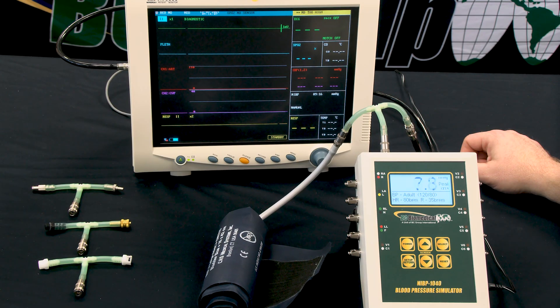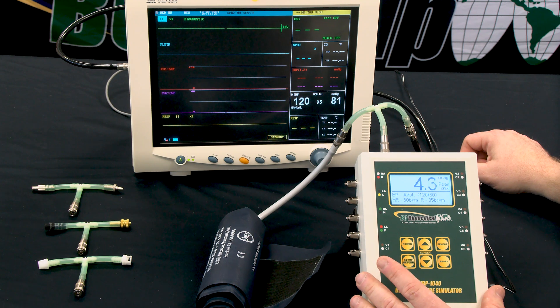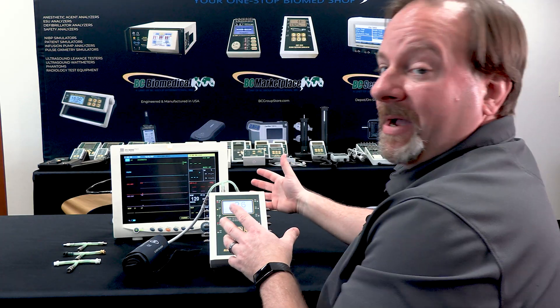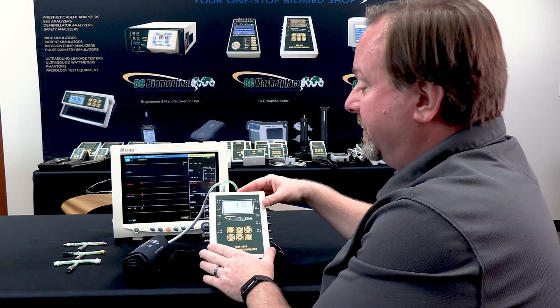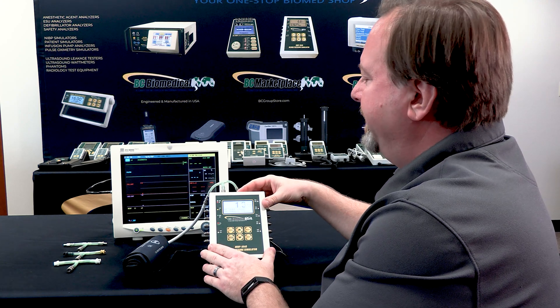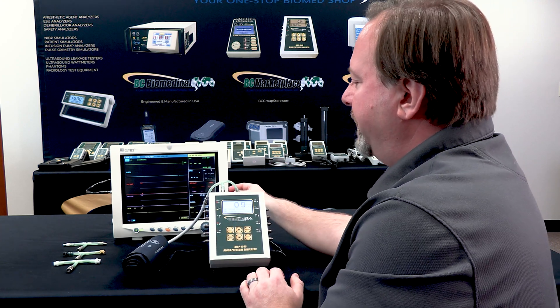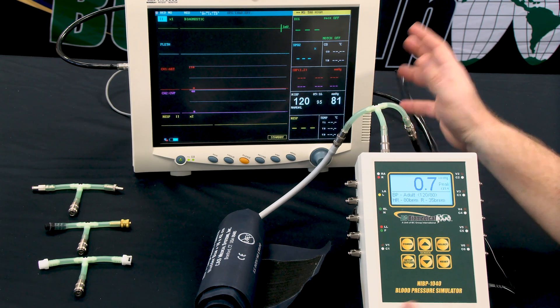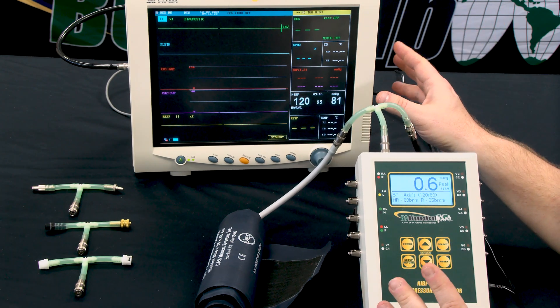There we go, 120 over 81. So in this case, different monitors may respond to our algorithm for simulating blood pressure. In this case, we got a reading of 120 over 81, which is pretty close to what we're expecting.